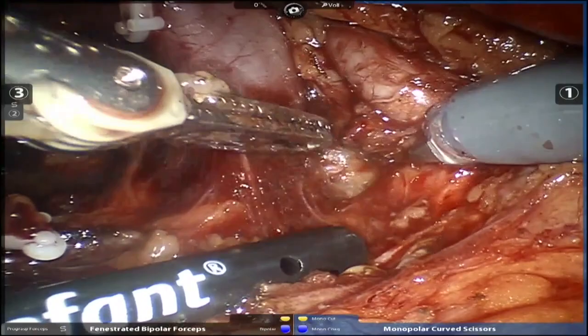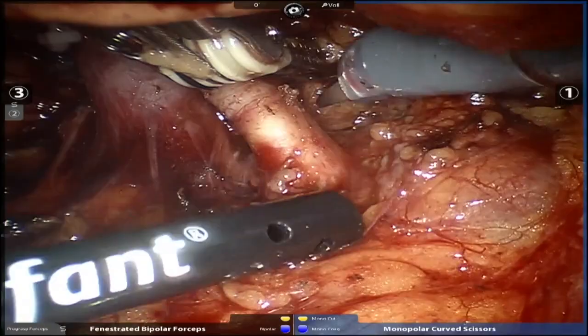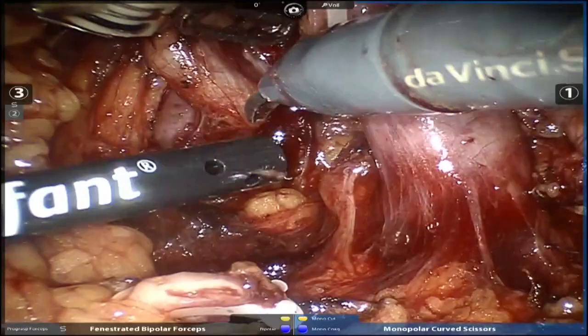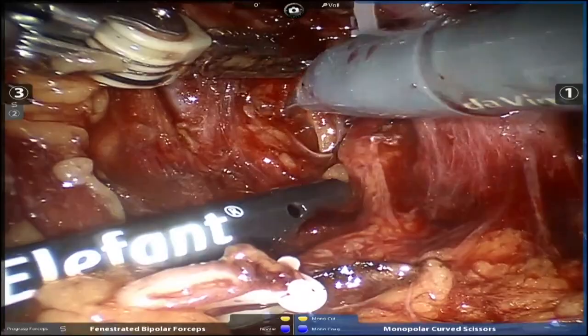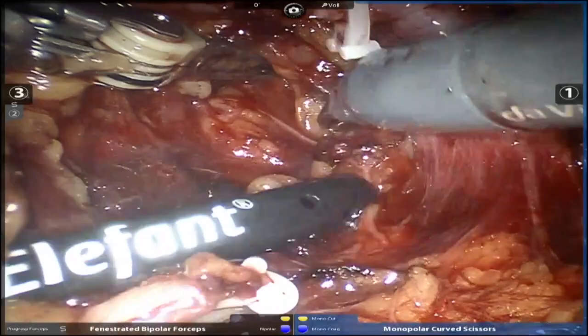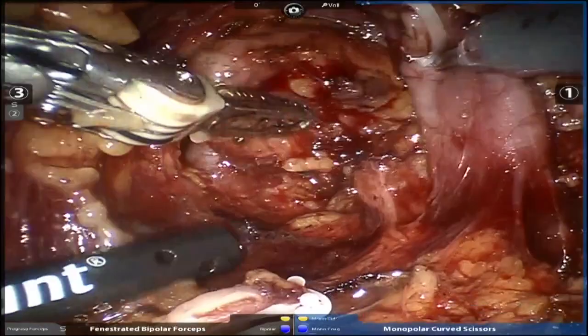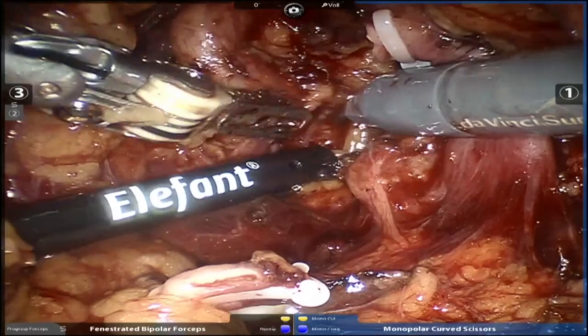Right here, Brando, please. Yep. All right, there's aorta. Okay, now let's go back to this. So this is aorta. Where is this coming off? Let's trace it down, Brando. Right here, buddy. Right here. Like it's curling in front of the main renal vein. No, it's certainly a segmental artery. Come from the main renal artery. Yeah.